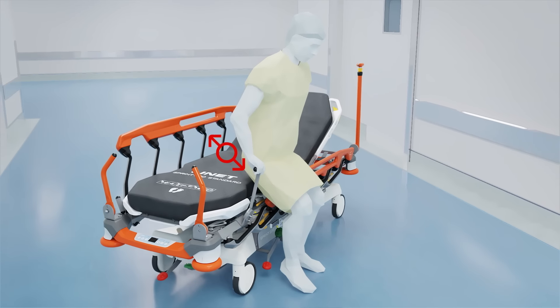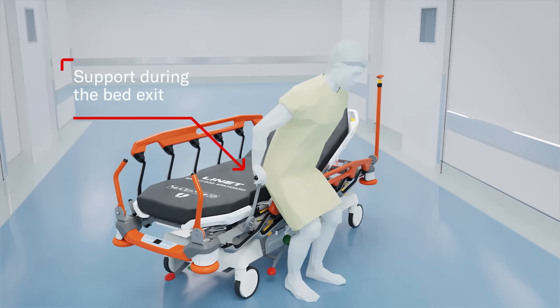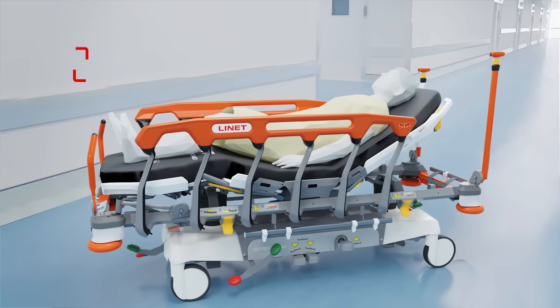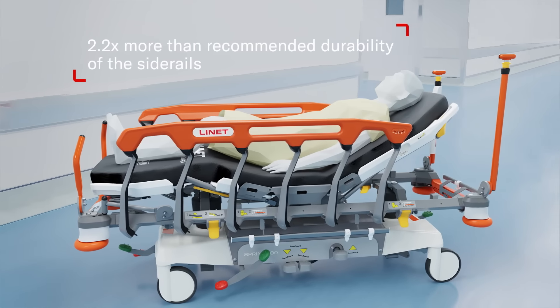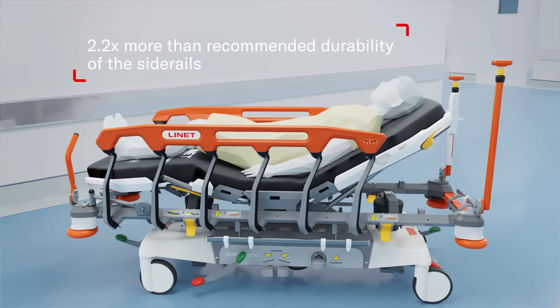When leaving the stretcher without support, the patient is at increased risk of falling. The mobile lift handle can provide a helping hand. Secure side rails cover most of the patient's body and protect them from falling out without compromising access for the caregiver.